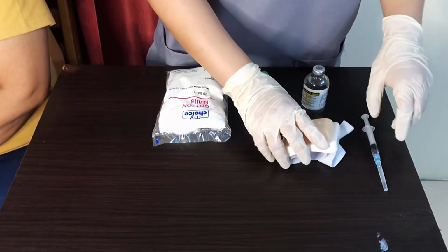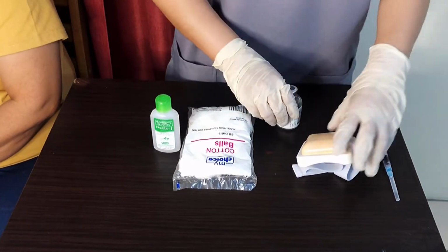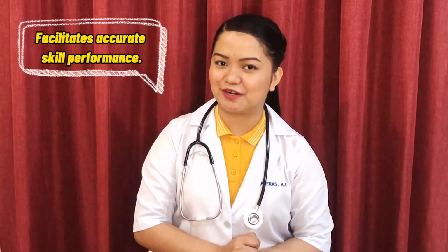And then, gather your supplies. To prevent the spread of infection, and organization facilitates accurate skill performance.